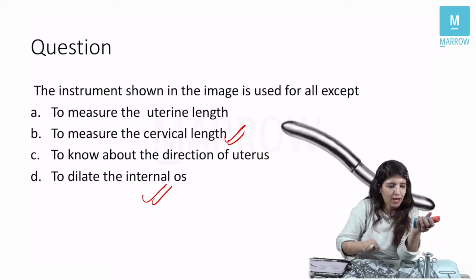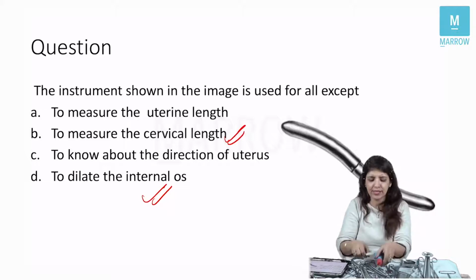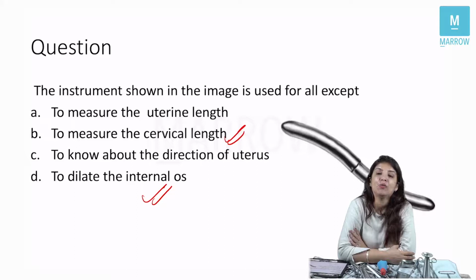Now, one more use of the dilator. Can anyone think and tell one other use of a dilator? One very important use of a dilator, which I forgot to mention in the previous slide, is if you have to diagnose cervical incompetence in a non-pregnant female.